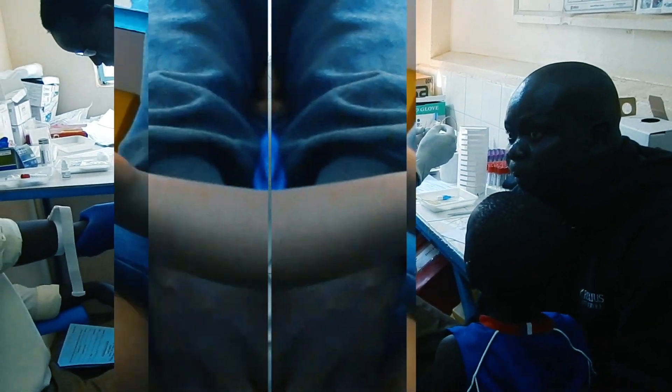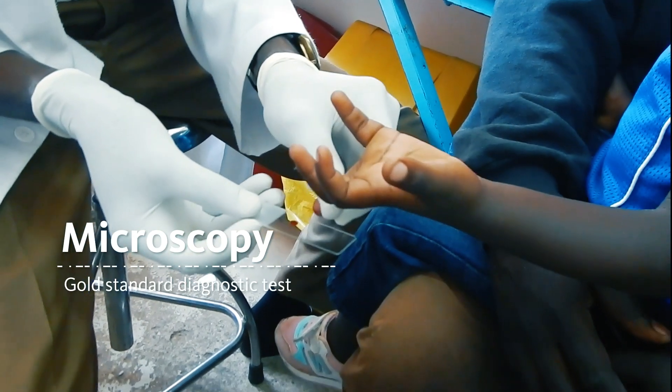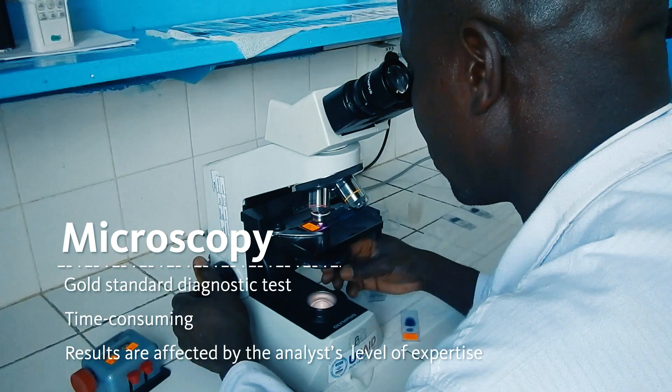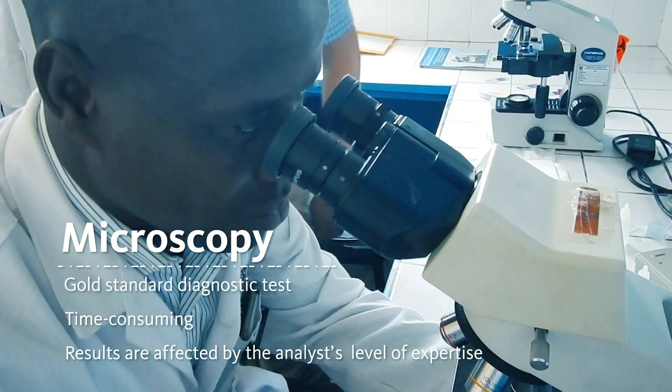Malaria testing. Microscopy has been the gold standard diagnostic test, but it is time-consuming and the results are affected by the analyst's level of expertise.